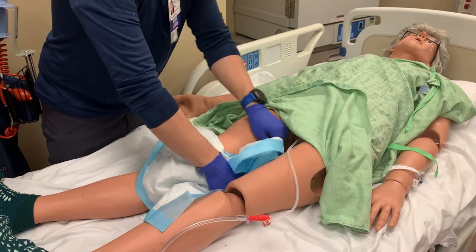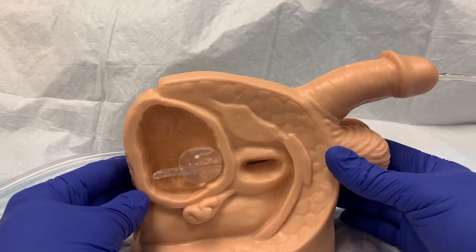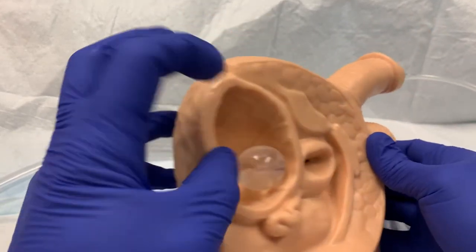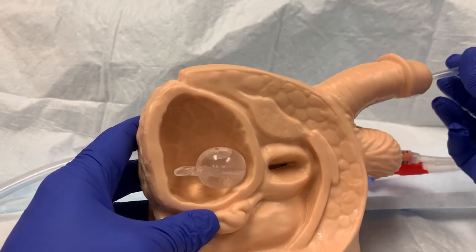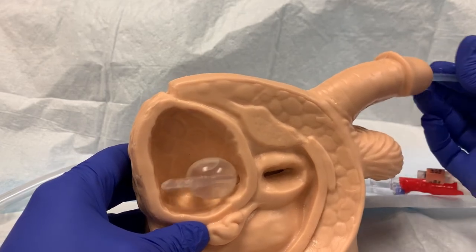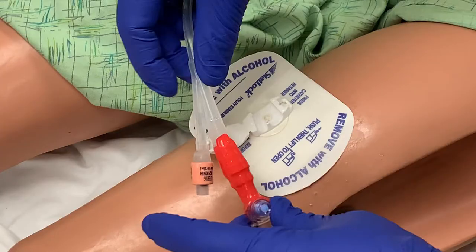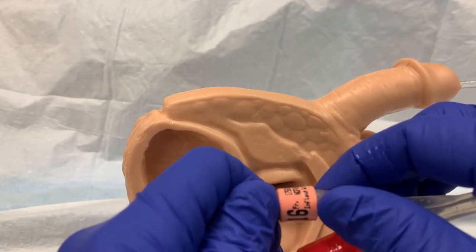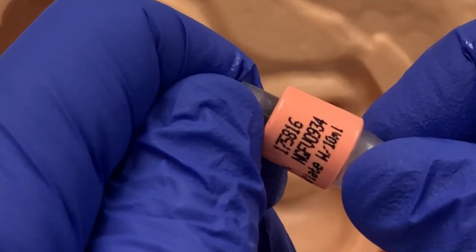Place the blue pad under the patient to protect the linens from any leakage during this procedure. The Foley catheter is held in place inside the body by a balloon that is inflated with water upon insertion. If the catheter is pulled at any point, the inflated balloon will stop it from being removed, and the patient will feel pressure and pain. To safely remove the Foley, the balloon will need to be deflated. Where the catheter tubing ends and the drainage tubing begins, there is a Y junction. The port at this location is connected to the balloon. Around the port is a colored ring with writing on it — read it to ensure you know how much fluid should be in the balloon.